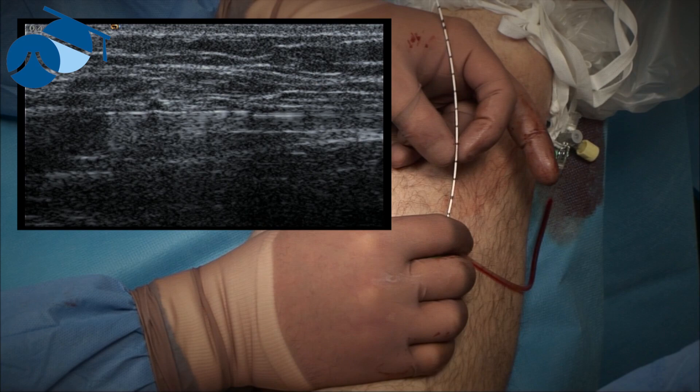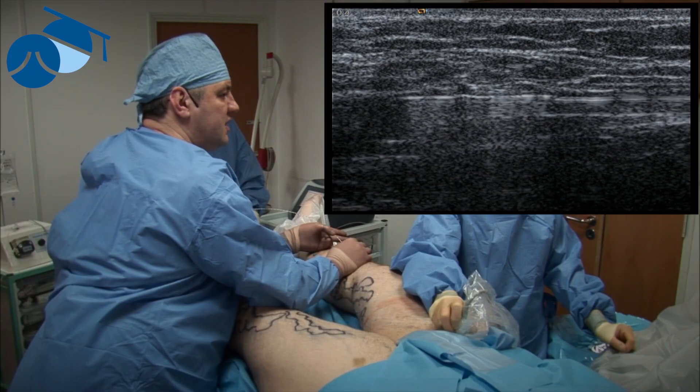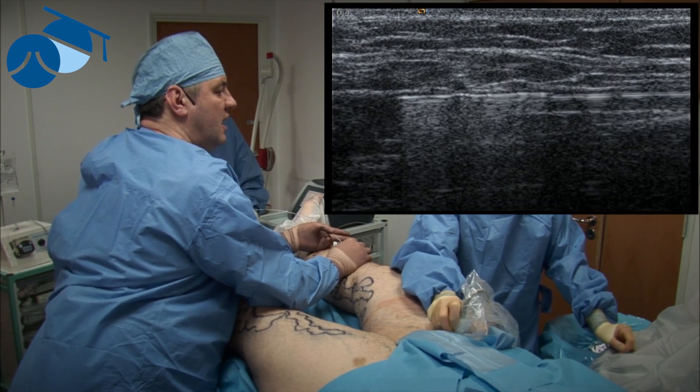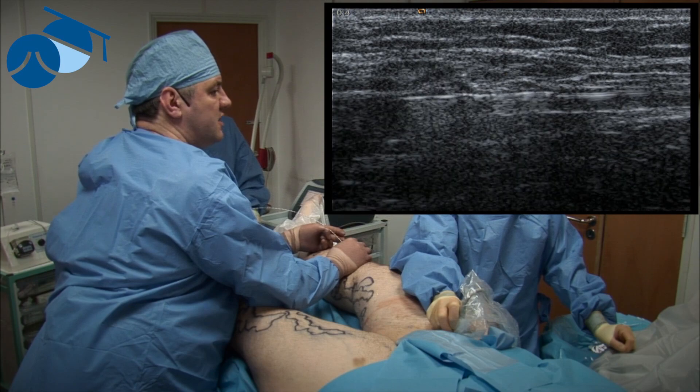This is why we prefer the radial firing system — we can go right up to here with confidence that we're not going to cause a thrombus proximal to that, and we're not going to destroy any matter in front of the laser, only to the sides.